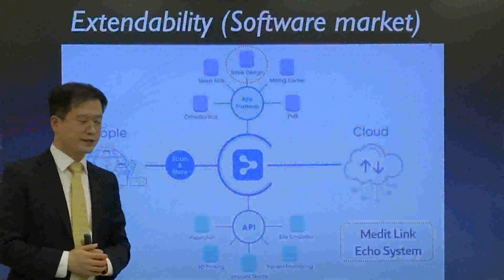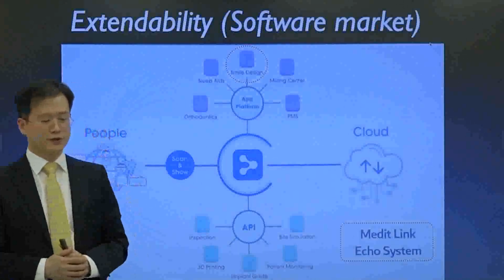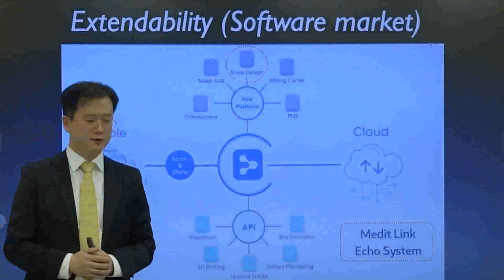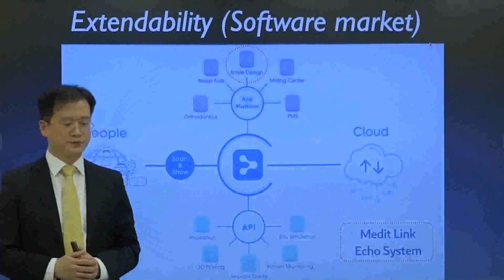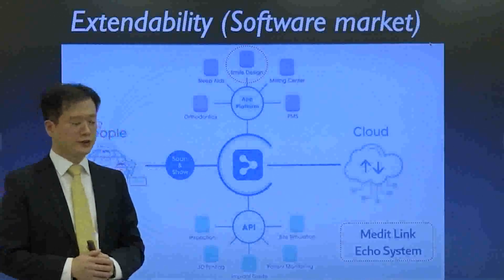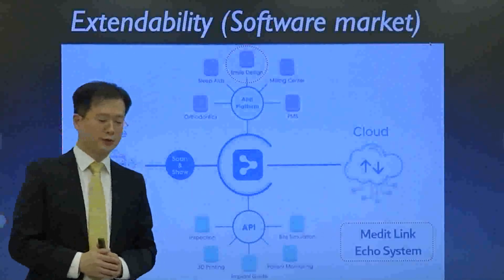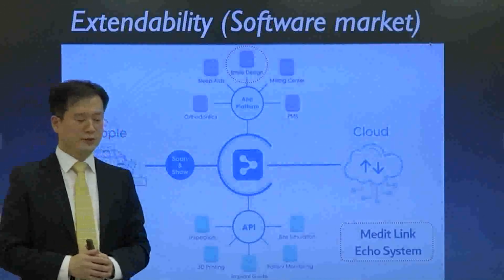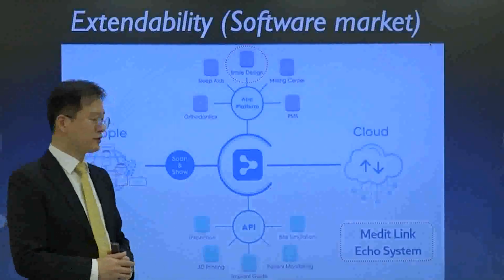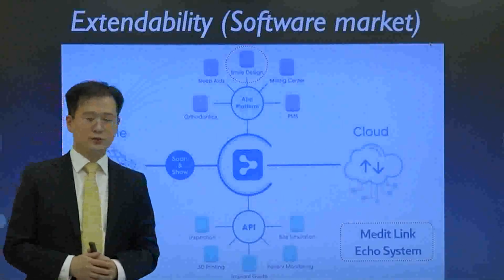It is the last slide. Scanner companies are continuously upgrading their software capabilities and are adding additional features to leverage scan data in a variety of ways. After I scan the patient's mouth with a brand new intraoral scanner, data is automatically uploaded to the cloud, and platforms like the smartphone App Store will provide us various applications to take advantage of convenient features such as smile design and auto creation of provisional teeth.